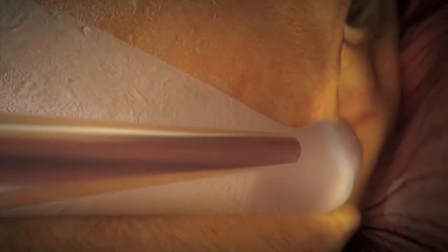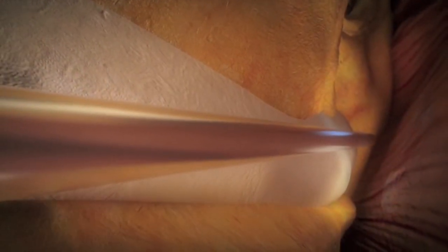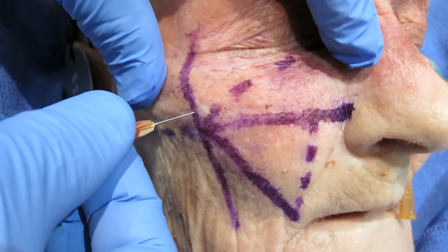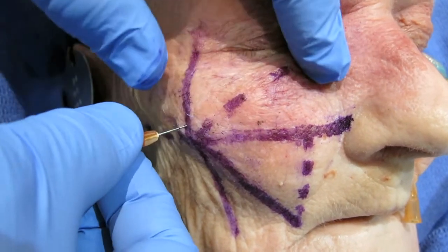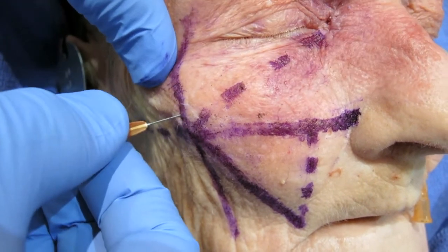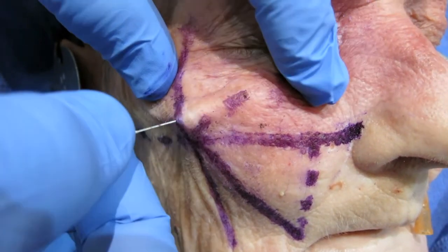When the injector places the cannula in the suborbicularis plane, they will feel a glide along the bone. In this specimen, we utilize a pinch and pull technique and pass the cannula along the orbital rim. We demonstrate the depth of our cannula in the suborbicularis plane.